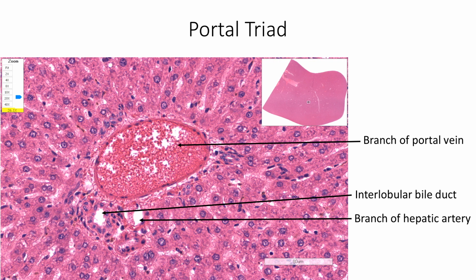Between the portal canal and surrounding hepatocytes, there is periportal space of Mall. This forms the site for the beginning of lymphatic drainage of liver. Lymphatic vessels which begin here will also travel along with the portal triads.